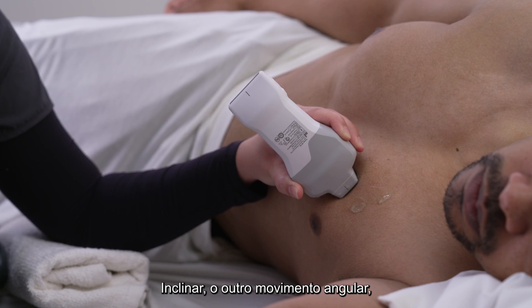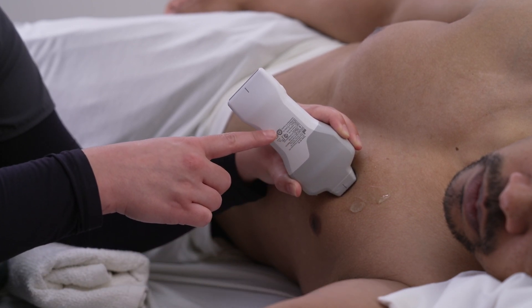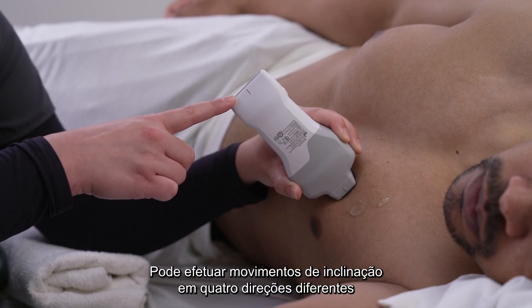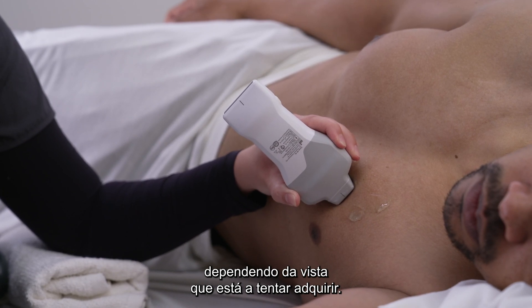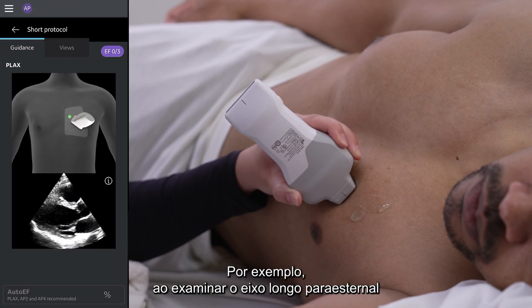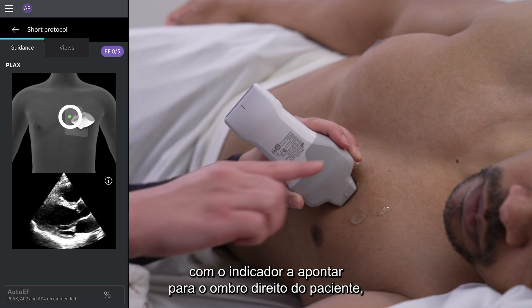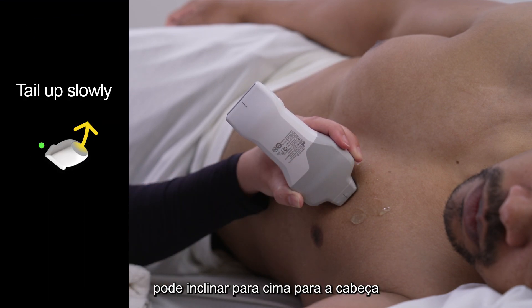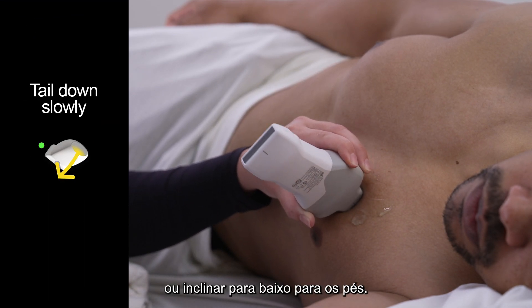Tailing is the second angling movement, performed along the non-indicator axis. The tail also refers to the end of the probe. You can make tailing movements in four different directions depending on the view you are trying to acquire. For example, when scanning the parasternal long axis with the indicator pointing towards the patient's right shoulder, you can tail up towards the patient's head, or tail down towards the patient's feet.